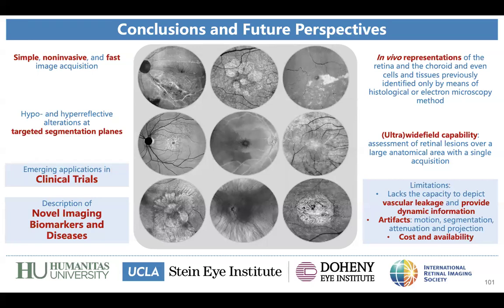I mean, our patients rarely need something more. Of course, also fundus autofluorescence and other techniques. But I think that en face OCT, of course, it's not a miracle, but it does have some limitations. But I really think that for me now, it will be very difficult for me to practice without en face OCT. So I think this is the main point.